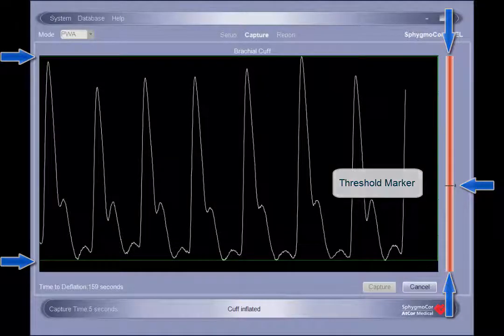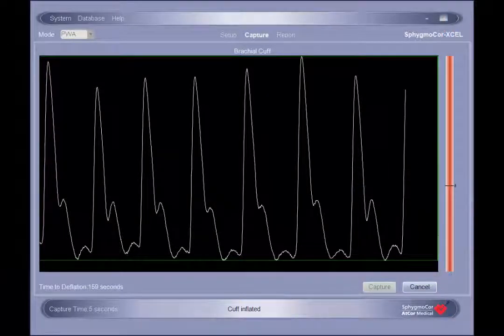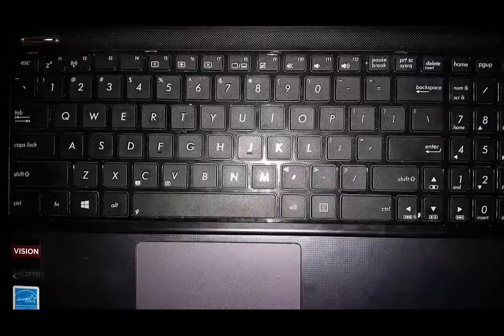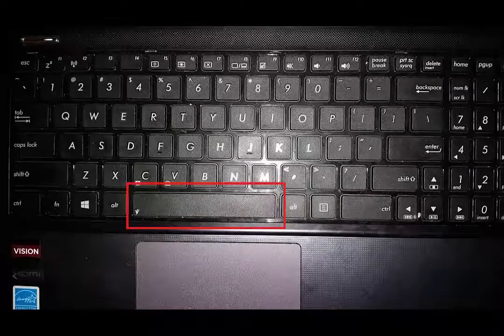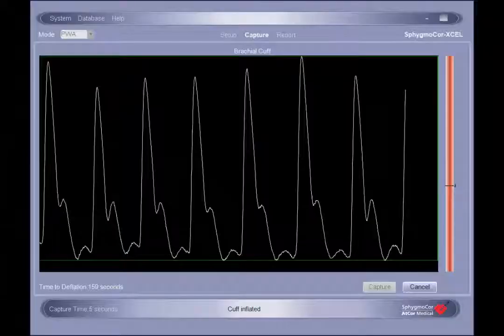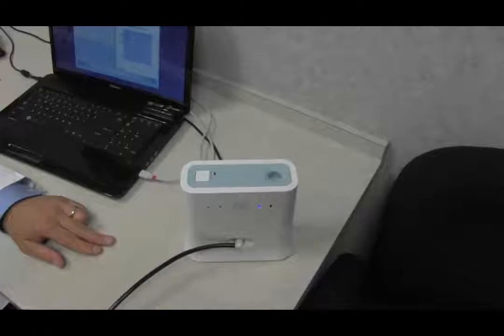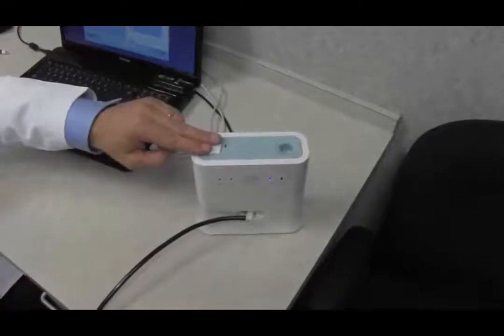However, some circumstances may require the operator to manually capture the assessment. This can be accomplished at any time by pressing the space bar on the computer keyboard. The cuff can be deflated and the assessment ended at any time by clicking on cancel in the capture screen or pressing the stop button located on top of the module.